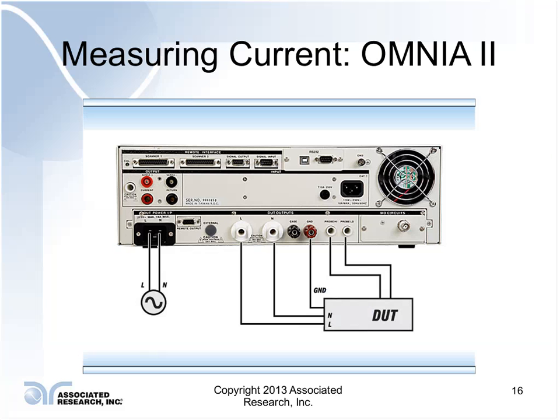So I'm obviously going to use the example of the devices we manufacture to show you how a leakage current test would be run. Now, as many of you know, there is a broad spectrum of leakage current devices on the market, but many of them operate in a very similar fashion. Like I mentioned before, we have these ground rules that we need to follow and very specific relays that need to be switched to measure leakage current properly. This is just one way of doing it. So you could use this example should you happen to have a different leakage current unit and not this particular device to show you what I'm talking about.